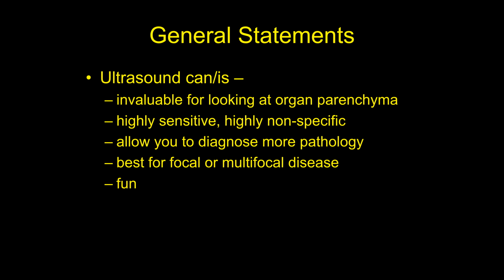Now, having said that, we're going to spend the rest of the time talking about ultrasound, about how to narrow those choices down. And if you had to go make a bet in Vegas at the ultrasound craps table, how to narrow that down and make an intelligent, educated guess that you can help with your clients. What do I think? Is this most likely benign? Is this most likely malignant kind of thing? Okay.